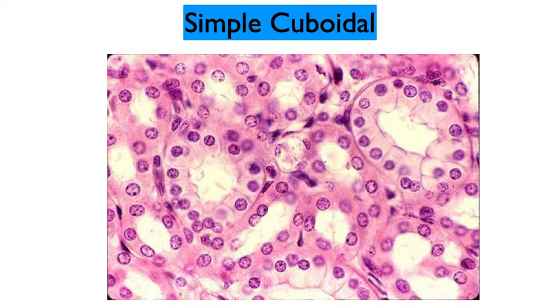These tubules are bunched up against each other, and it looks like between some of the tubule walls you can see some blood vessels, maybe red blood cells in those blood vessels, those capillaries, providing nutrition to these living cells. So wherever you want secretion and absorption to take place, obviously a very highly desirable feature. In the kidney tubules, you're going to have simple cuboidal cells. So let's go on now.